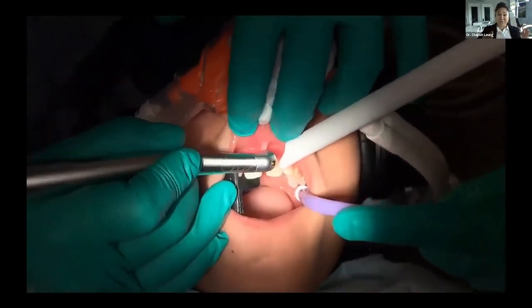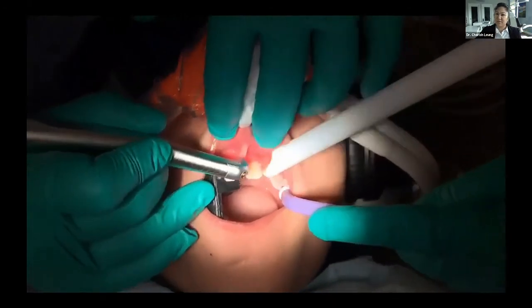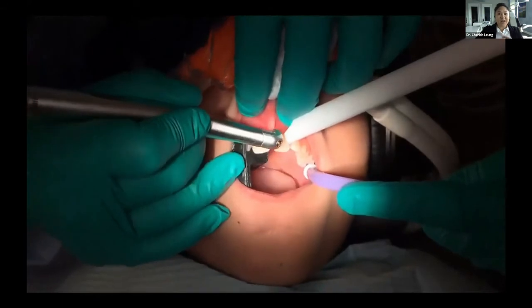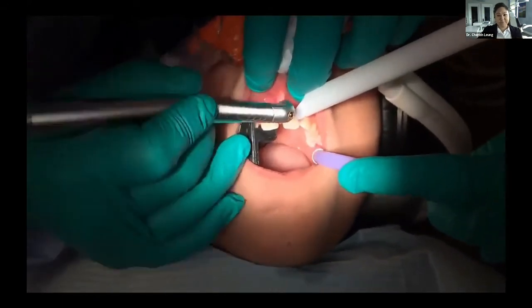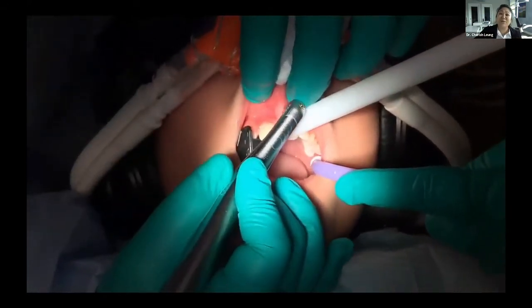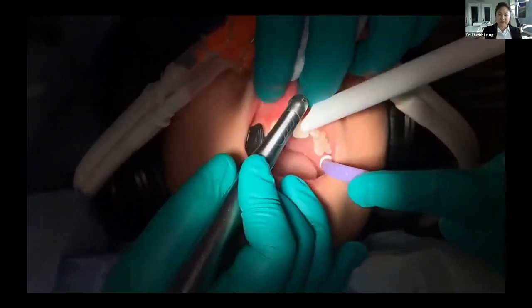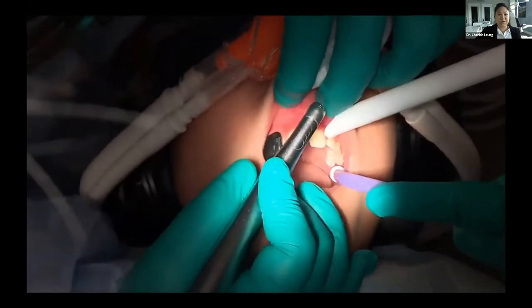Now, when you open up a frenum, what happens a lot of time, especially if it's a super strong frenum, is you'll see like 4 or 5 little strings in there, and you need to release each of those little strings. Some of the ones I've seen that are really, really strong, you'll see like 10 little strings in there. So you'll want to release all those little fibrous connections in order for you to get a full release.